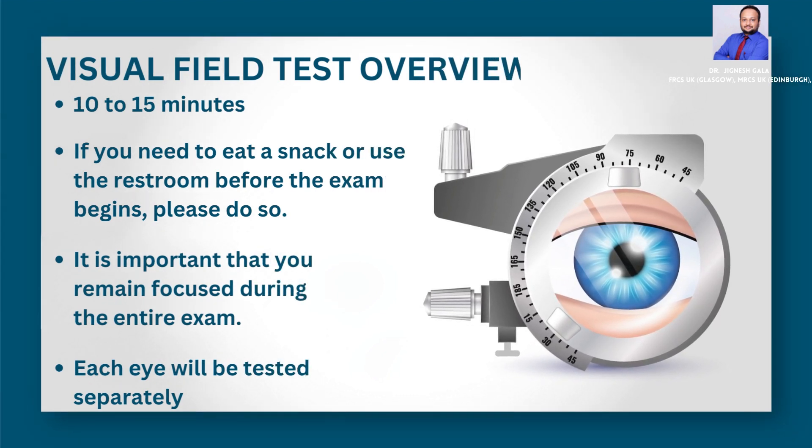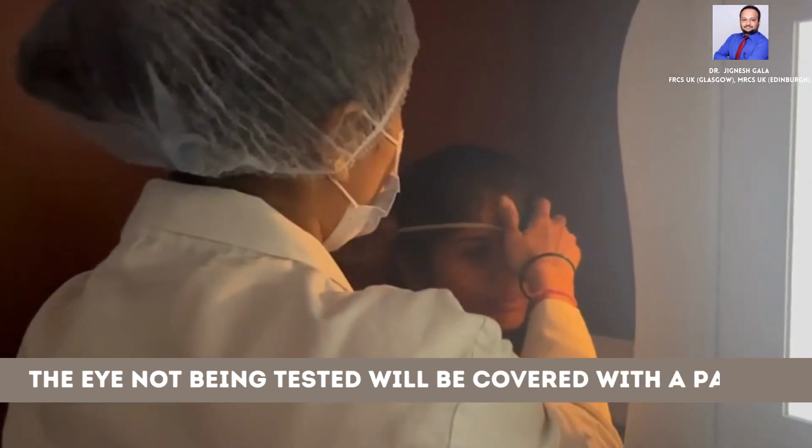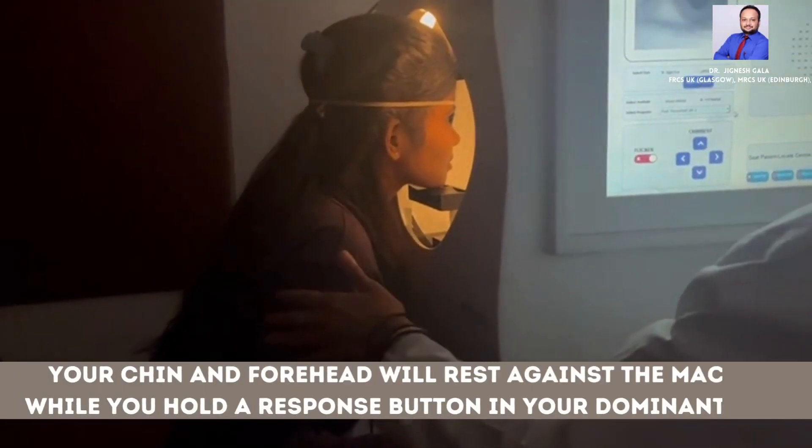It is important that you remain focused during the entire exam. Each eye will be tested separately, and the eye not being tested will be covered with a patch. Your chin and forehead will rest against the machine while you hold the response button in your dominant hand.